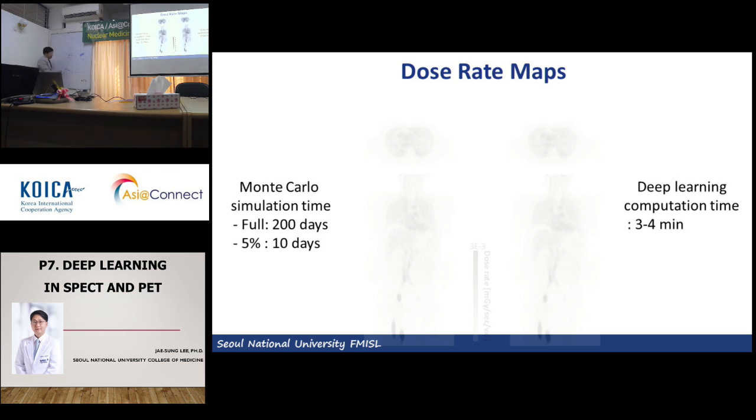So then the S value. But if it is going to become voxel-based dosimetry, every voxel is going to become the source, and every voxel becomes the victim or recipient of radiation.